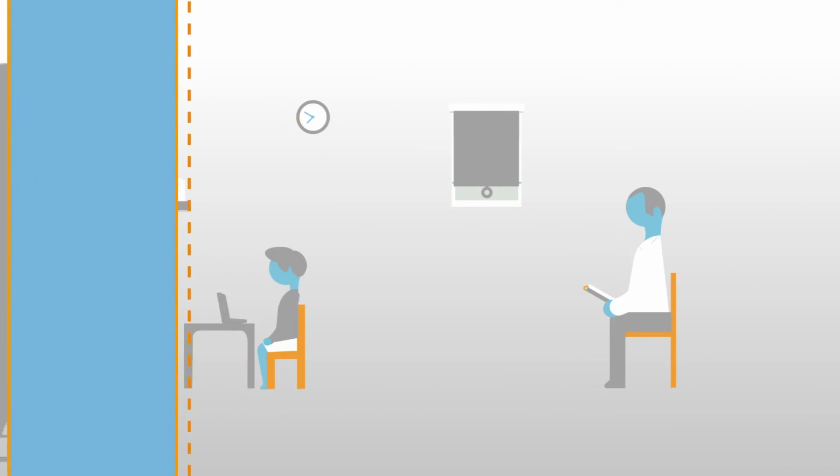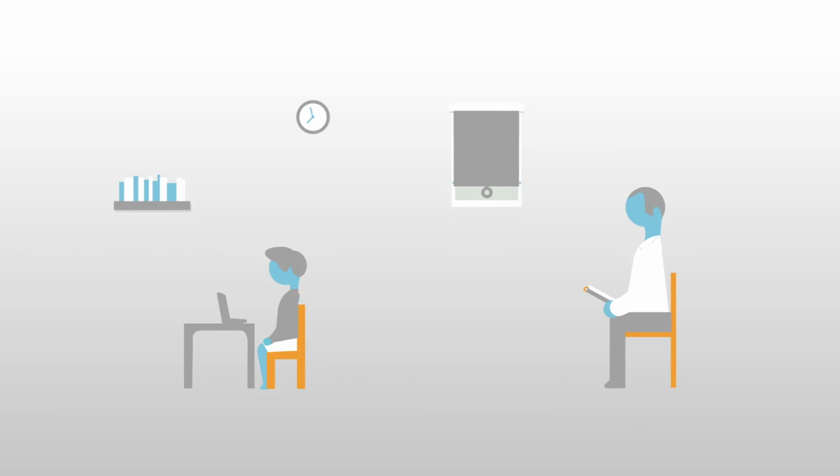During the test, it is recommended that you avoid any distractions that might interfere with the patient's concentration. It is recommended that you sit behind the patient. Also, make sure no one enters or leaves the room during the test. It is also recommended that no one else should be present in the room, other than yourself, the examiner. If the presence of an additional person is required, such as when young children are involved, the person should be seated quietly at the opposite end of the room.